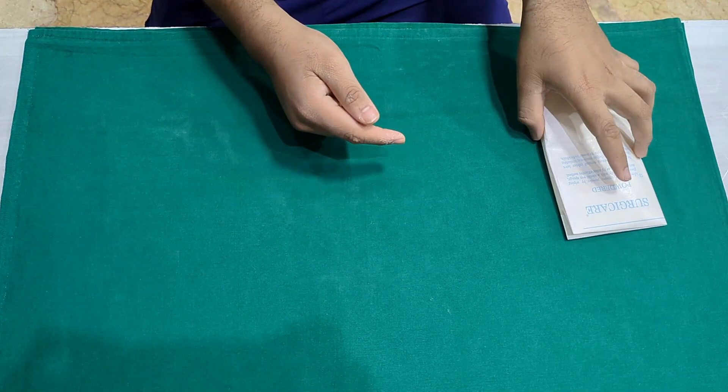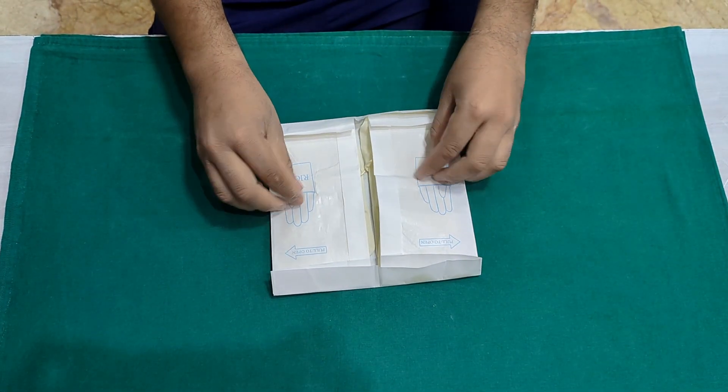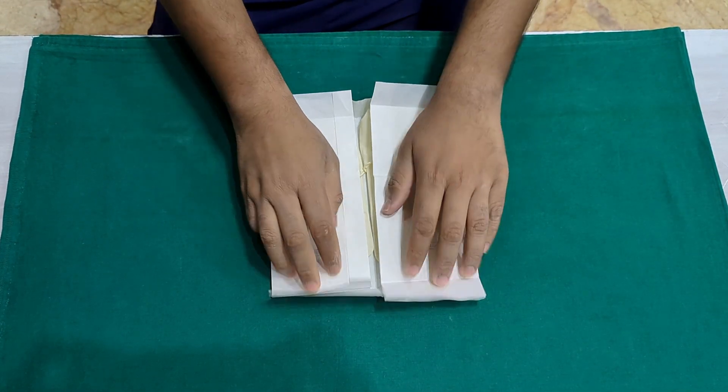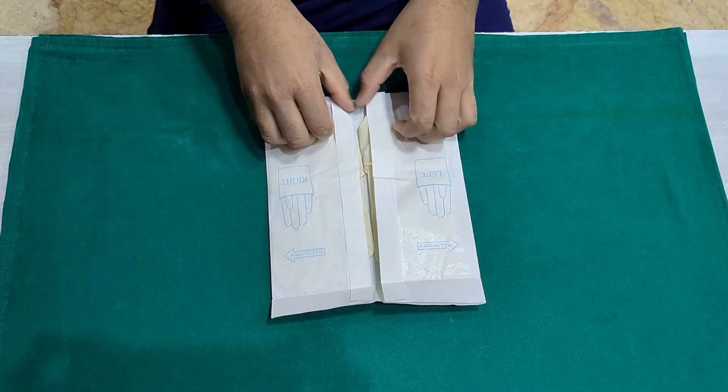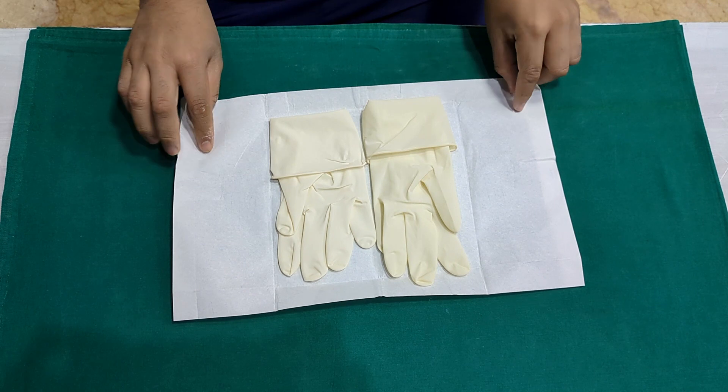When opening the second package, it is important to just touch the outside of the package. Grab the outside and open it. You will see that the cuffs of the gloves are folded back on themselves to expose the inside of the gloves.